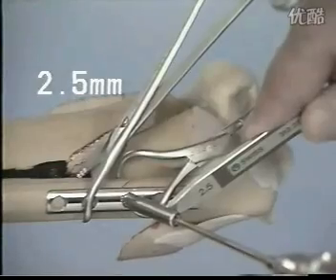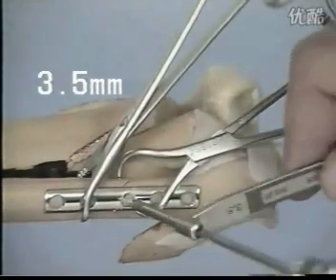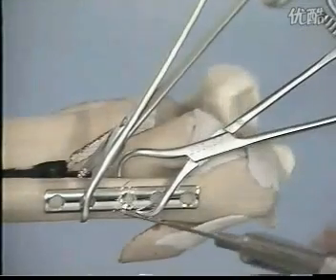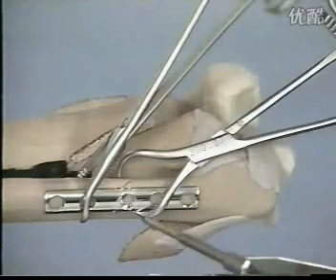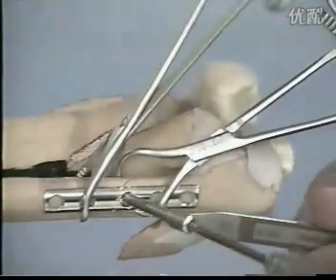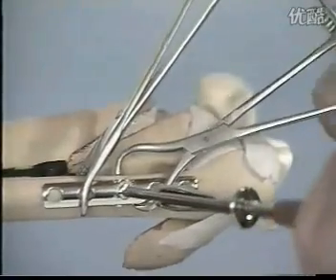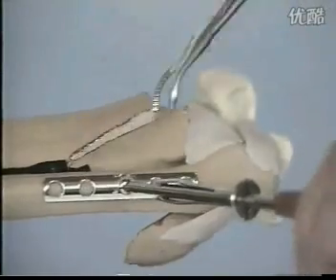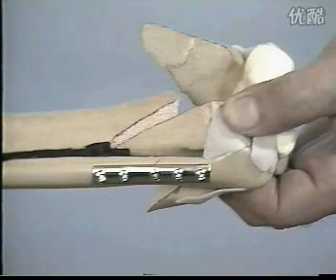We drill a 2.5 mm hole through both cortices, a 3.5 gliding hole close to the plate. Measure the depth. Cut the thread in the opposite cortex and insert the screw. All other screws are inserted as usual. This secures the fibula and determines the length for the reconstruction of the pilon.